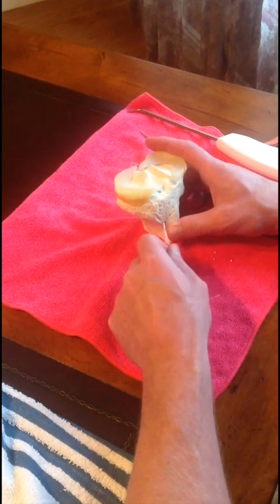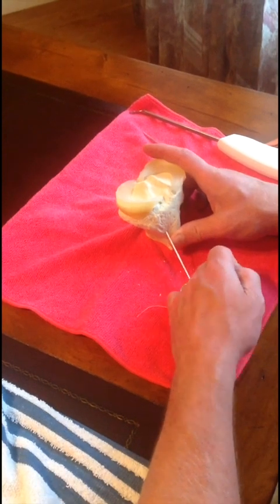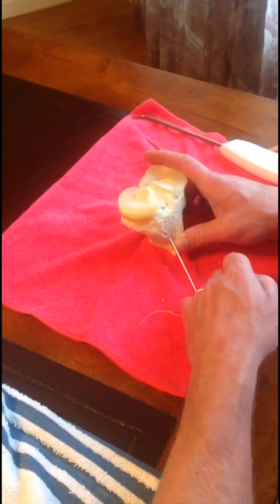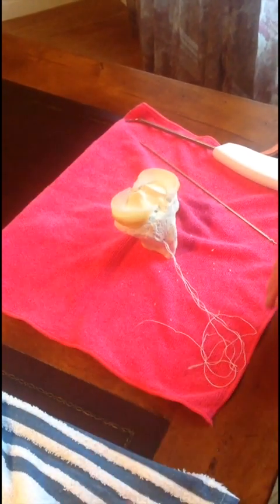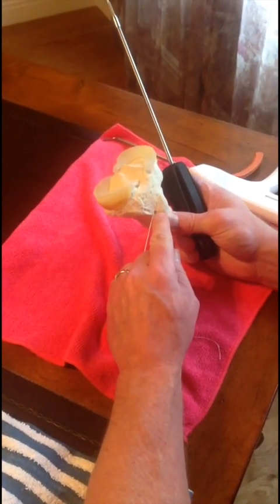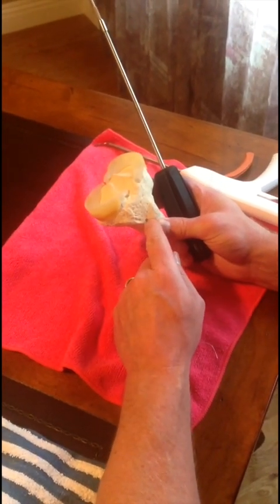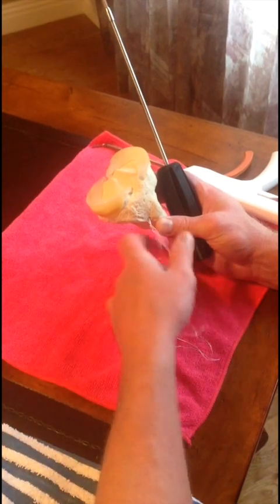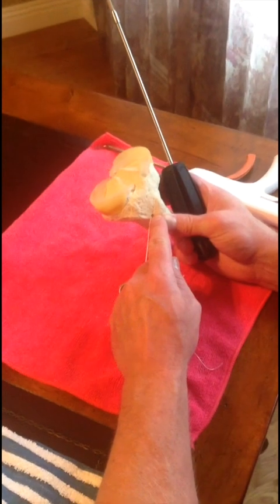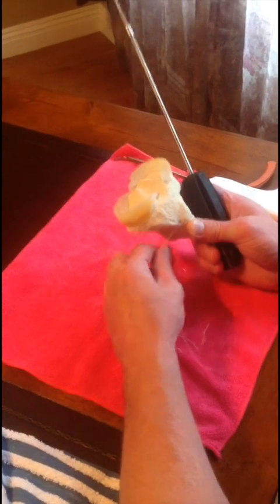Now we're down into our tibial tunnel and we can start pulling our tension. By doing it this way we're able to securely hold the tension instead of trying to tie over a button. Remember we've already punched and tapped for our tibial anchor. I prefer PEEK because the biodegradables tend to fracture here. Once you've got a good secure position and you like the tension on your sutures, use one of these commercially available suture anchors. This design has a pilot that will go up into the tunnel and then the anchor will disengage and screw into the tunnel itself, securing my sutures.